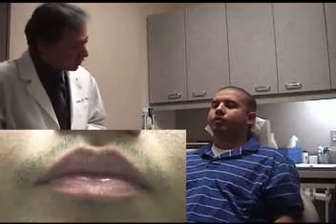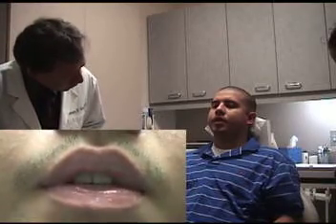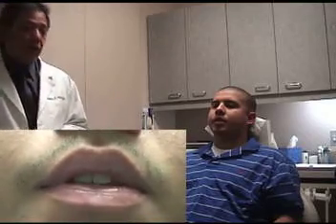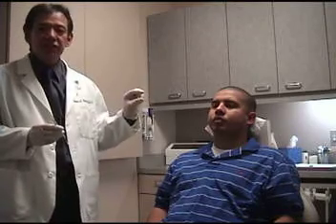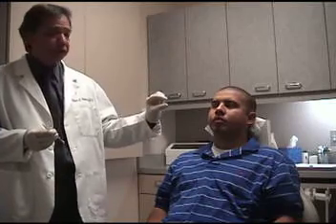We can see that as he was speaking. Can you do that again, please? 66, 67, 68, 69, 70, 71. We'll notice that there's about half a millimeter separation between the incisal edges in his speech sibilant phoneme position at the S position that we're using.